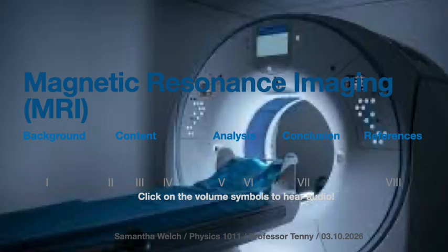Next, the MRI machine sends radio frequency pulses into the body. These pulses temporarily disturb the alignment of those hydrogen nuclei. When the radio frequency pulse stops, the nuclei are able to relax back into that alignment with the magnetic field. As they do this, they release small electromagnetic signals. Once again, according to the OpenStax physics textbook, this process is called nuclear magnetic resonance.